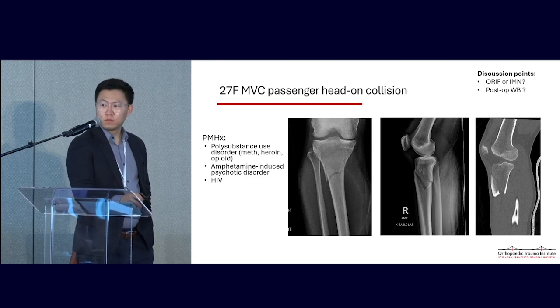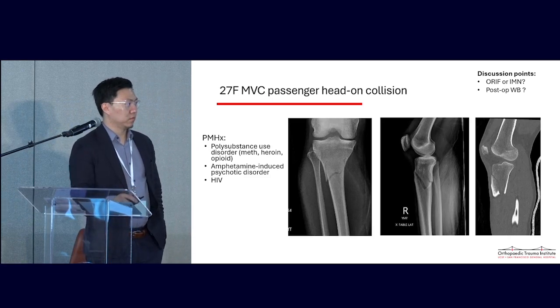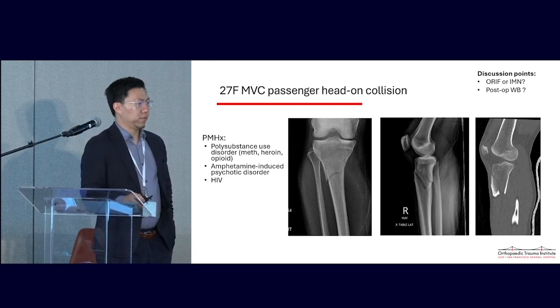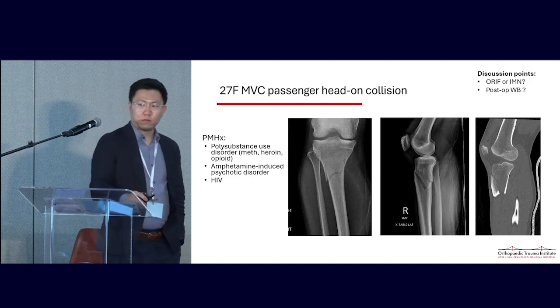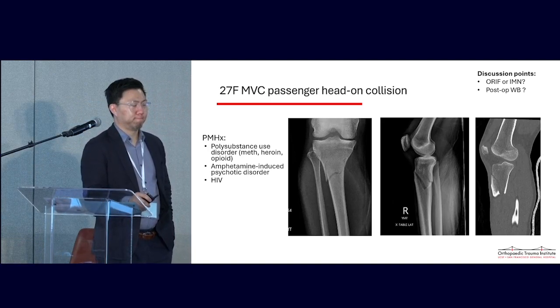So what position would you put the knee in to nail it? You do an actual suprapatellar nail? No, I don't do suprapatellar. Because you don't like going through the knee. I don't like going through the knee, but I go medial parapatellar, and Max Morandi kind of gave me credit for this a long time ago. In a way I just move everything laterally, and interestingly, you almost feel like you're extra-articular. Corey Collins did it as well, but the idea is that you can do it in full extension. The knee pain isn't like a regular infrapatellar nail, but you're not going through the knee joint either.